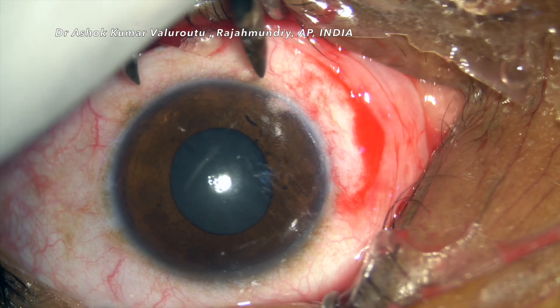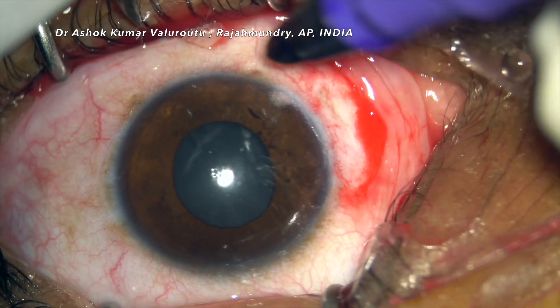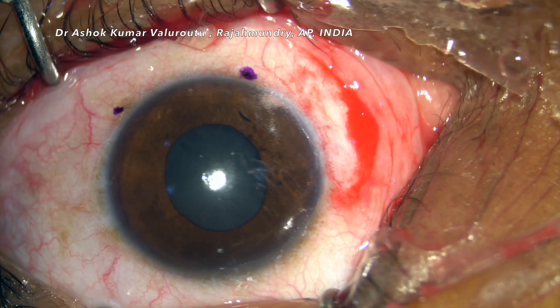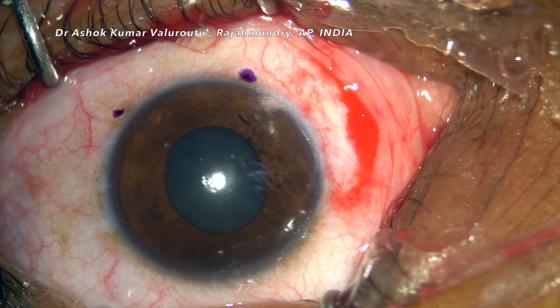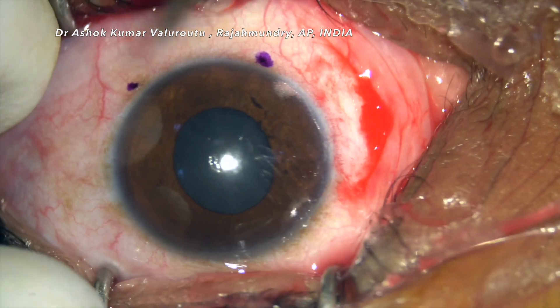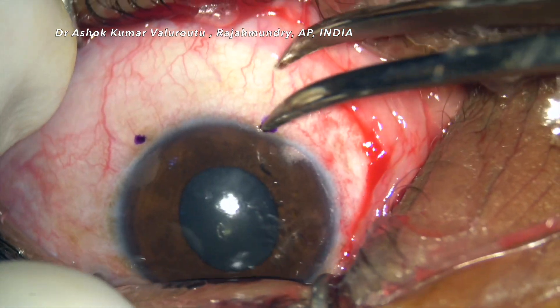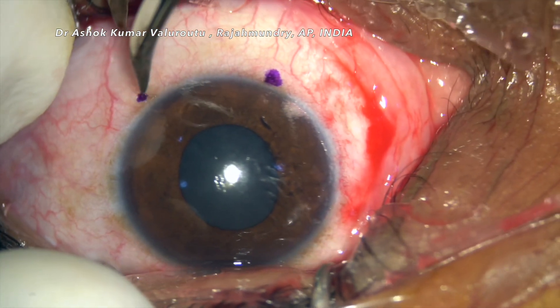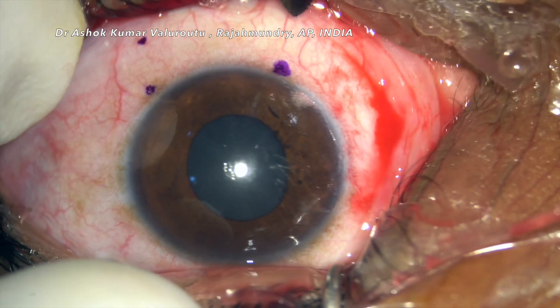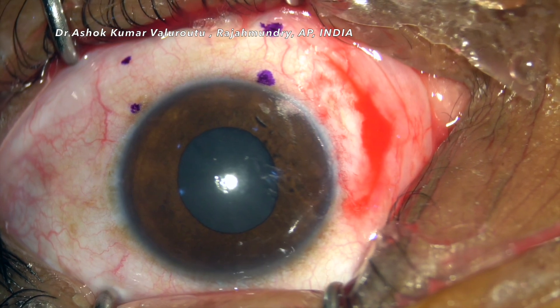Once the pterygium is excised and the cornea is cleared of any residual pterygium, the bare area is mildly cauterized so that any unnecessary oozing of blood from the blood vessels is prevented. Then marking of the host area is done.